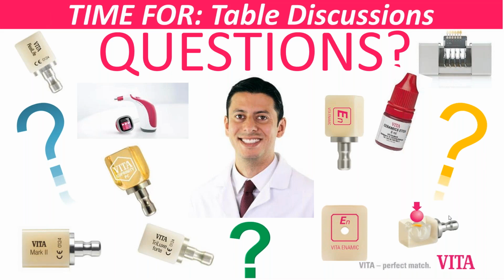So I would say it's a case-by-case decision, but if you are in a combination case, and let's say you have a moderate discoloration, let's say the Ambria T is a good option to mask up to a certain amount. If it's extreme, I would go with the first generation zirconia with a nice sleeve, and then on top you can use something more translucent if you want.